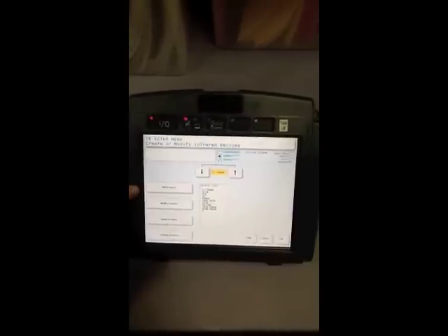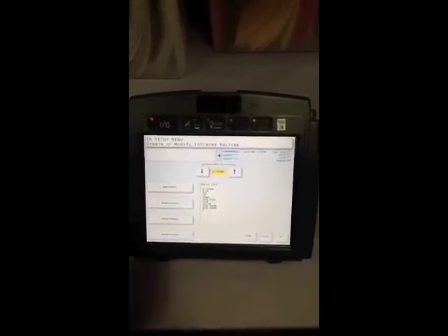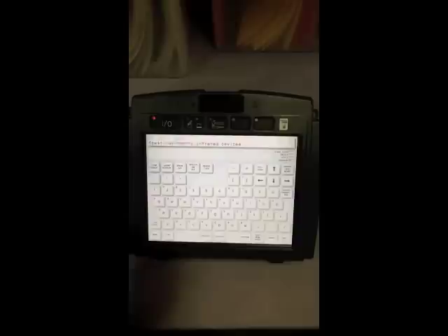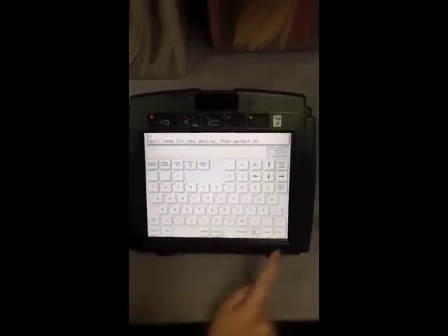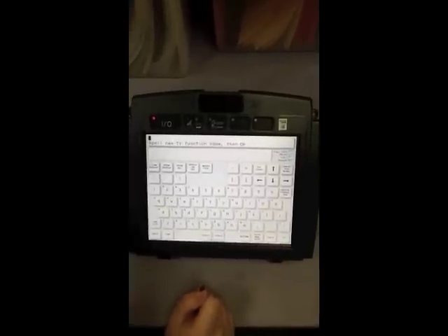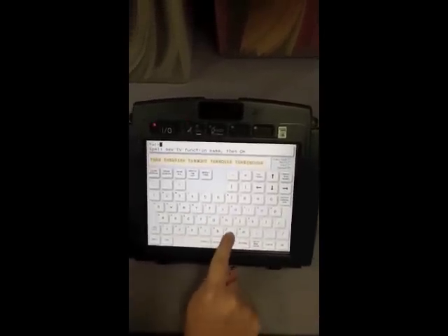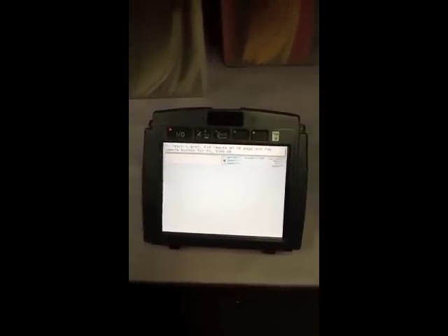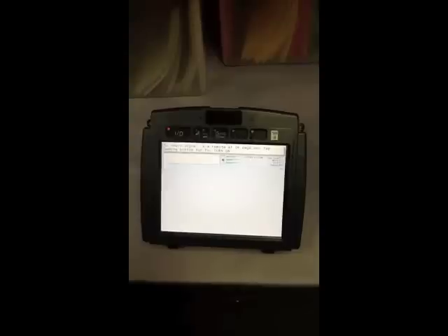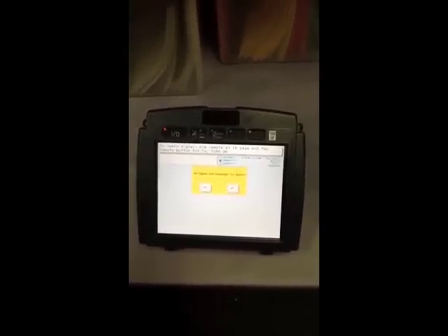We are going to show you how to access a TV using environmental controls in the Vantage Lite. So you push Add a Device. Here you type in the name for the device, push OK, and then you type in what you want the TV to do. So here we want it to turn on. You push OK. When you see this page, point your remote toward it to finish programming the environmental control. At this time, there's no signal present.